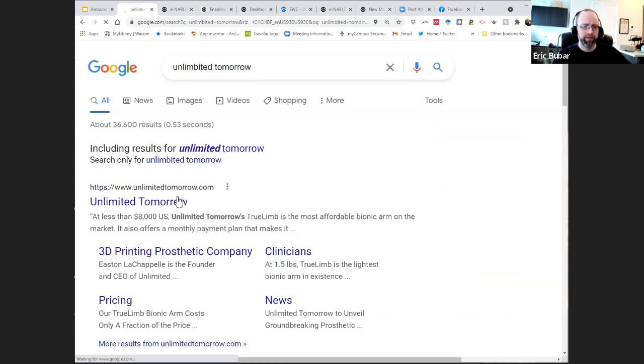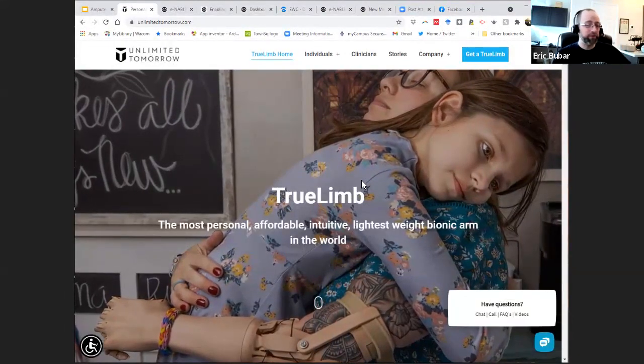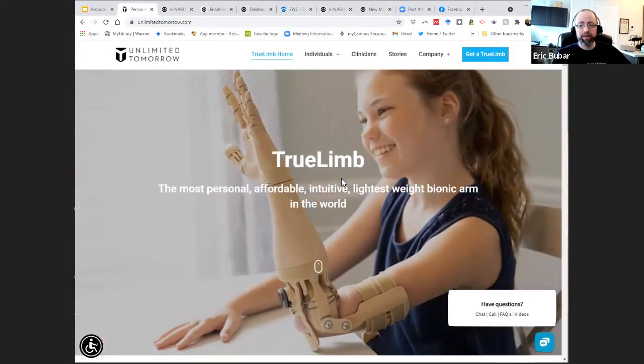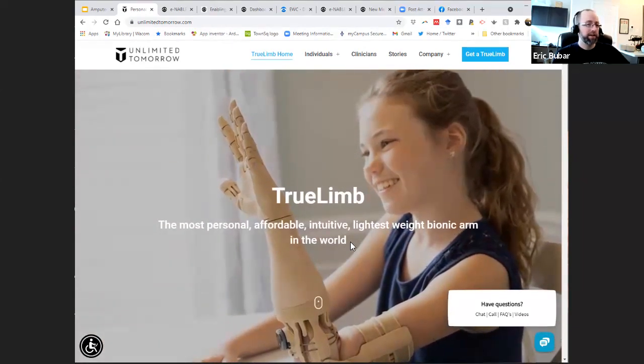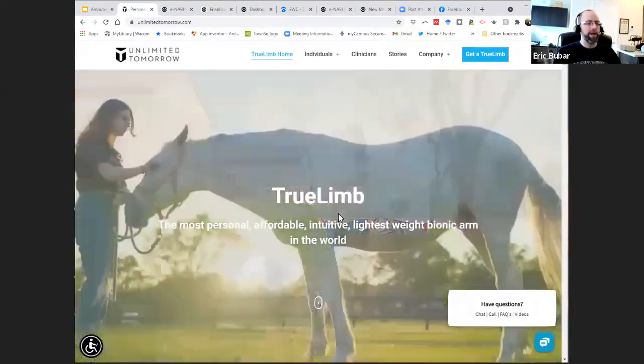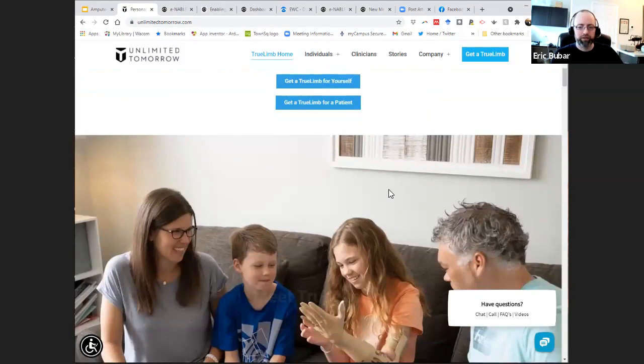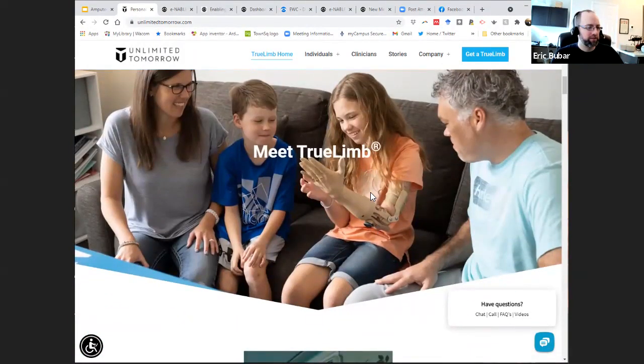The other organization that's relatively new in recent years is Unlimited Tomorrow. According to their website, they're about $8,000. They work entirely remotely with you. Their device is 3D printed on a very high quality industrial grade 3D printer, so not something that a typical Enable volunteer would have. This is a little different than Enable, but it is still able to provide you with a 3D printed prosthetic limb. It works with myoelectrics, and they will work entirely virtually with you. They will send you a 3D scanner to get a scan of your limb, design a socket for you to wear with myoelectric sensors, and work with you remotely through mail to get you a device that will work for you.